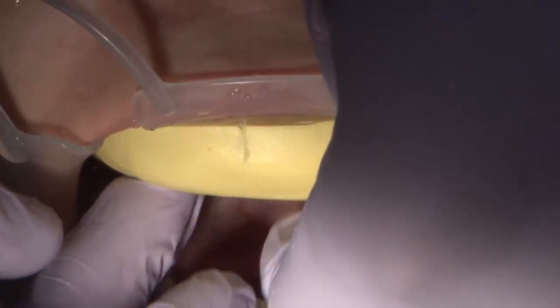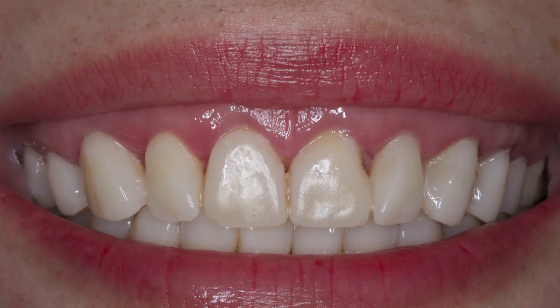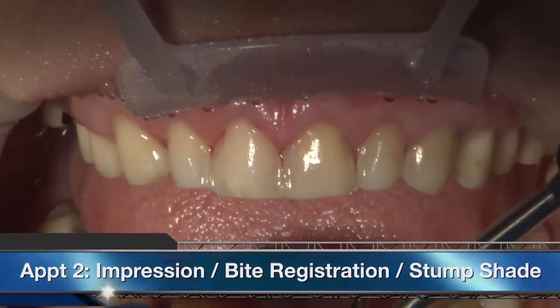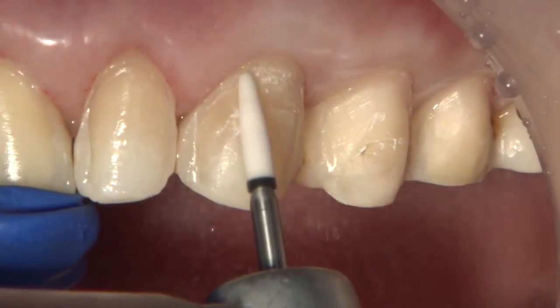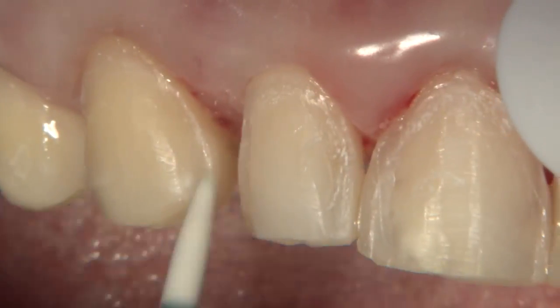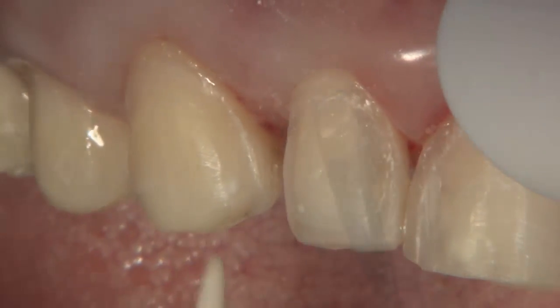Before the final impression, the patient wore the temporary for an additional week. Great care was taken to open the gingival embrasure so as not to create any damage to the papilla. At the final impression appointment, almost always after the removal of the temporary, there will be some areas that need to be cleaned up, so using a white stone will remove any residual from the area where the temporary was spot etched.